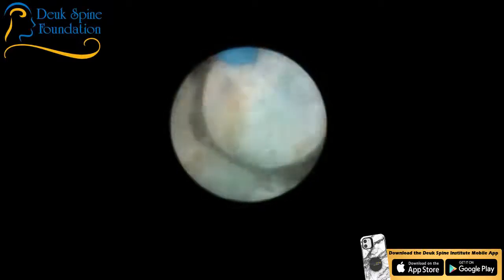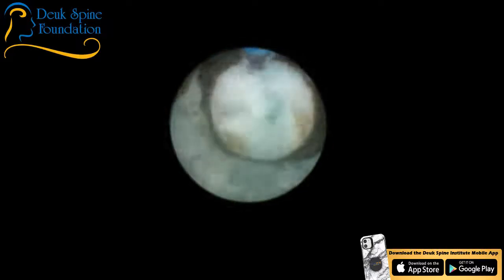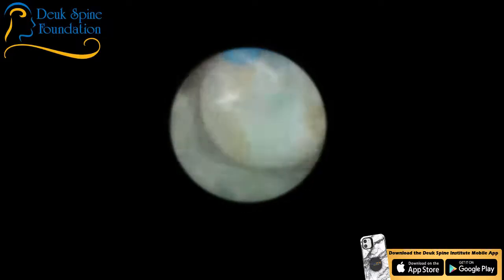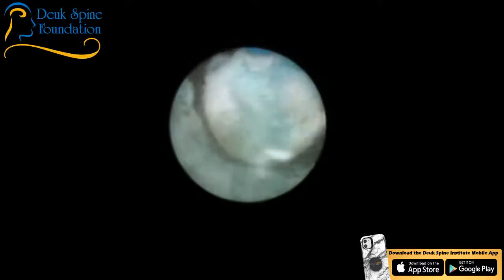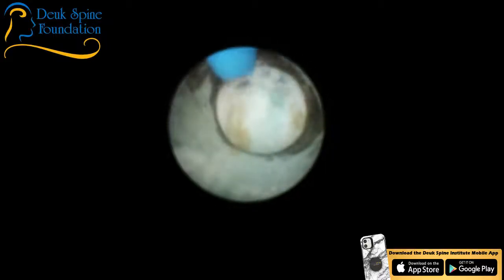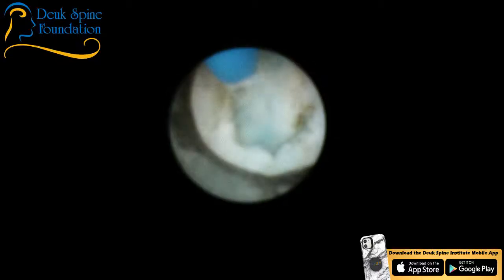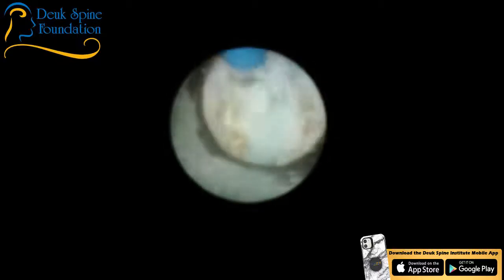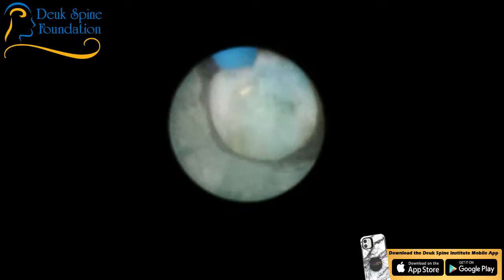But the problem is, to do that, you have to take the rest of the disc out, which means you're going to be putting something in there like a cage and a plate. So you have to fuse. If you're taking the whole disc out, you're going to be fusing. Patients that get their whole disc taken out that don't get fused or have artificial discs put in, they don't do well. They have pain, and they can get recurrent stenosis. Bone spurs get bigger from the abnormal movement. It's just bad outcomes.